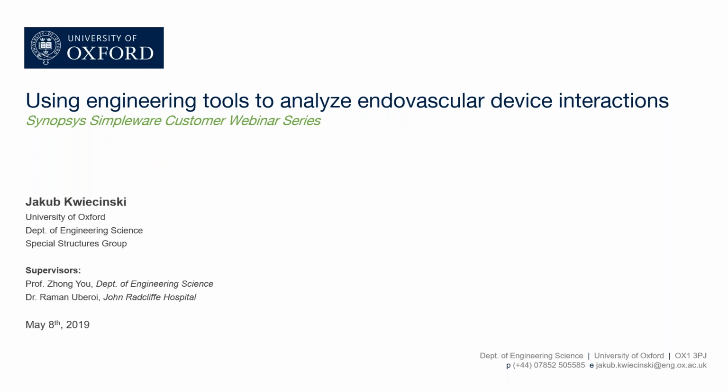Great. Thank you, Ross, for the kind introduction, and thank you everyone for joining this morning or this afternoon, wherever you're calling in from. My name's Jacob, and as Ross said, I'm going to be sharing with you today some research coming out of the Special Structures Group in the Interventional Radiology Unit at the John Radcliffe Hospital here in Oxford. And really sharing with you some engineering tools to analyze endovascular device interactions during complex endografting procedures.